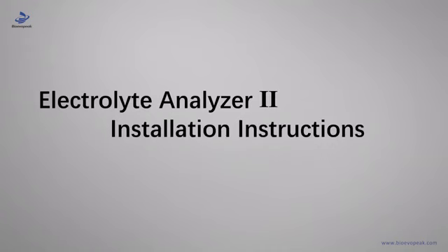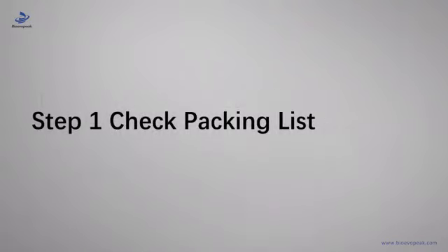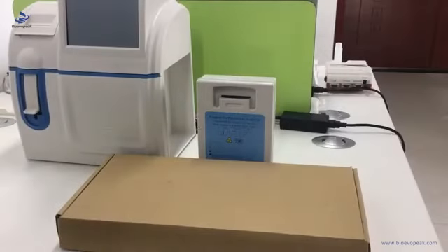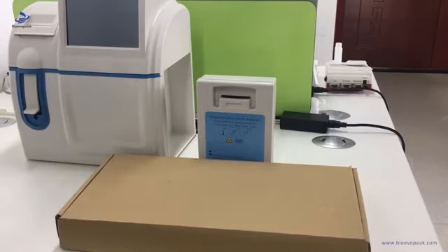This video will show how to do the installation for the electrolyte analyzer. First we take out the main machine, reagent pack, and the accessory, and put them on the table.